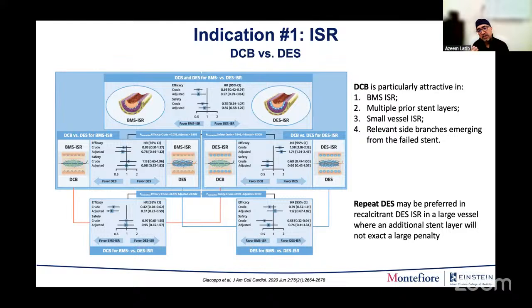Also, some of those studies, even though they were randomized, were smaller. They weren't balanced for the type of restenosis, diffuse versus focal. So the European guidelines for a long time had a drug-coated balloon as a class 1 indication for DES ISR. They recently downgraded that. They took away the class 1 indication. I think a lot of us still have concerns about that because it's based on data that has some flaws, but also it's not like stents are that much better.